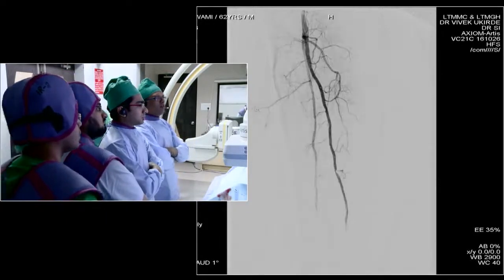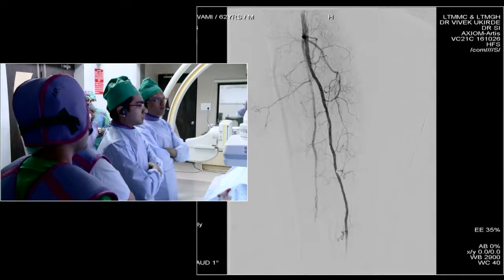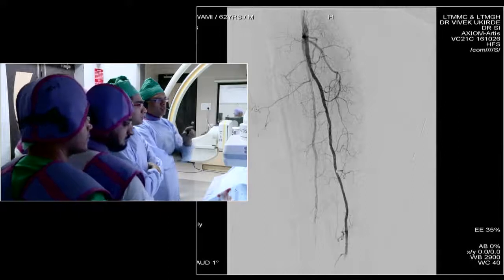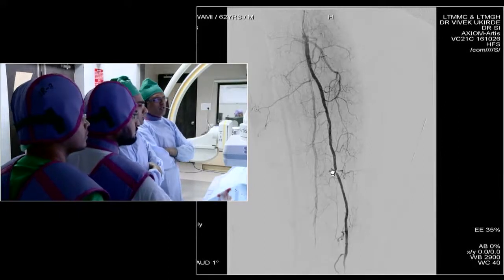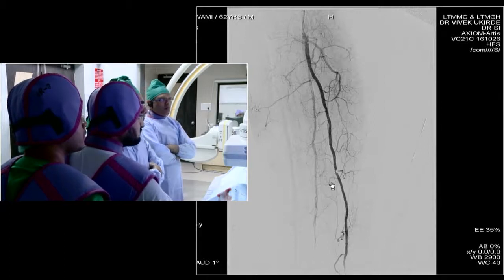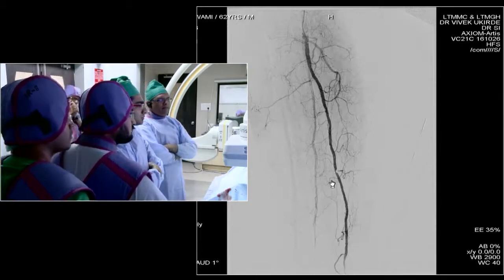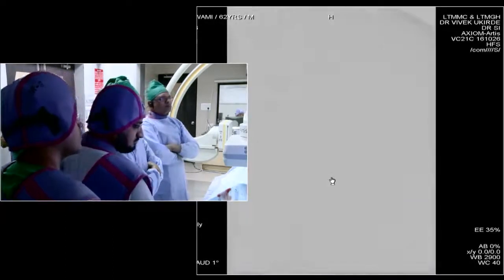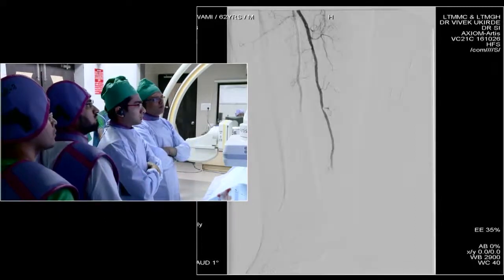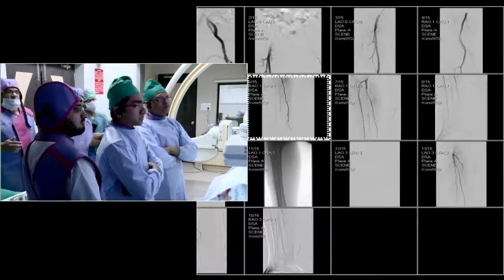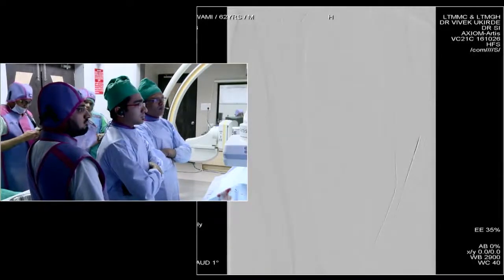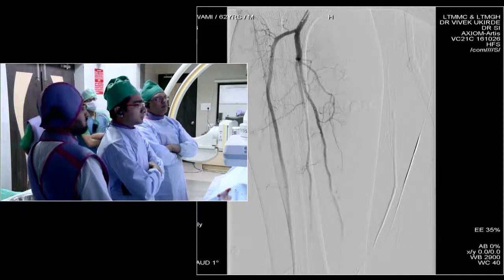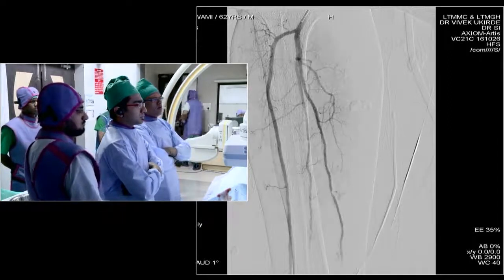This is a selective run of the PT trunk, which shows the posterior tibial and the peroneal. You can appreciate that small segment significant stenosis. When the other vessels are good, treating this small segment vessel may help the patient. This is the anterior tibial, which is seen very well till the ankle.